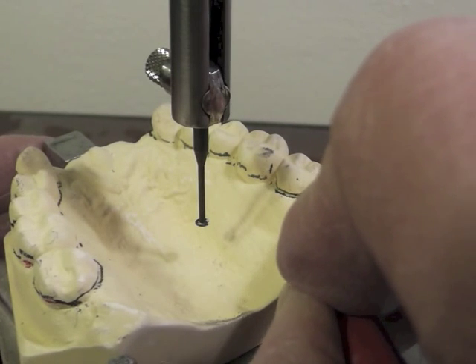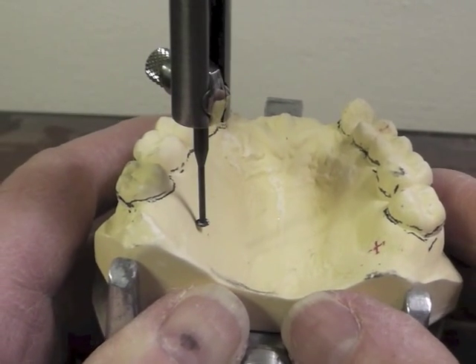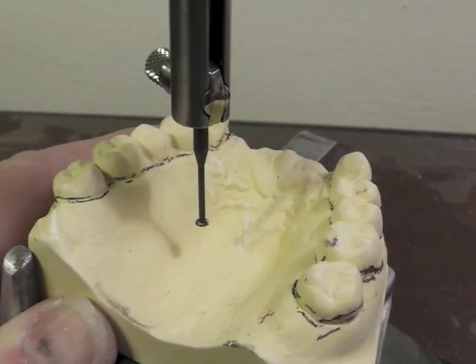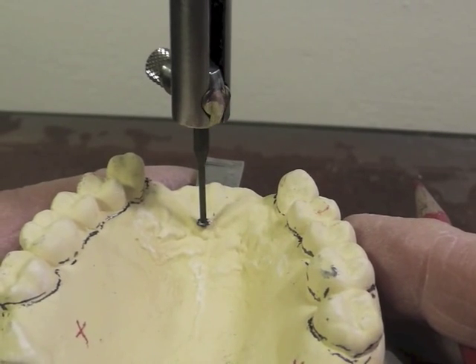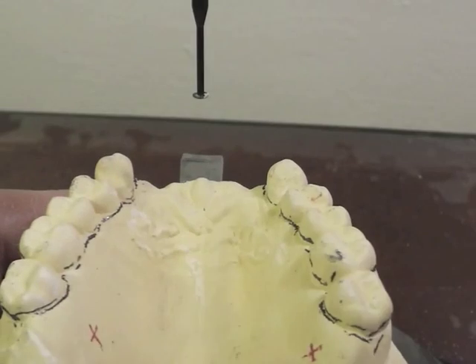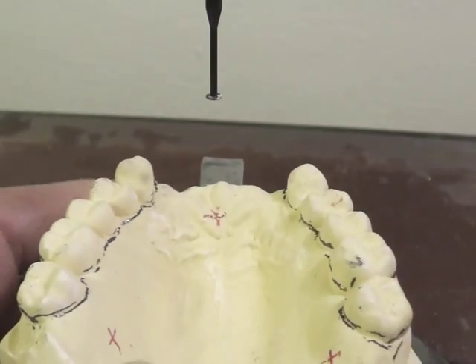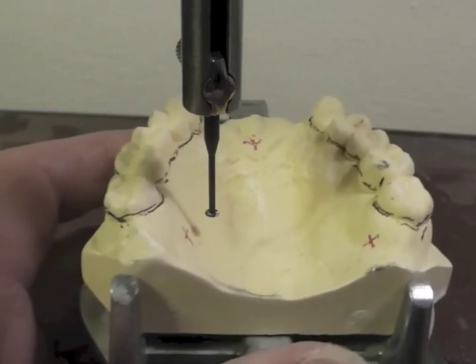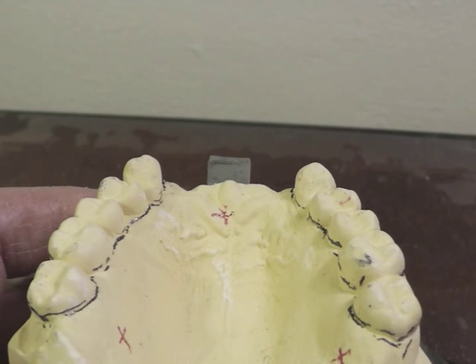Once I've found the three spots, I'm not going to move that gauge up and down. I'll make a little red mark — actually a cross — at each spot. I come over to the other side and see where it marks, make a cross there too, and then go to the anterior for the third widely spaced mark. The purpose of this is that when the cast goes to the laboratory, the technician can look at these three marks and orient the cast on his articulator touching all three positions.